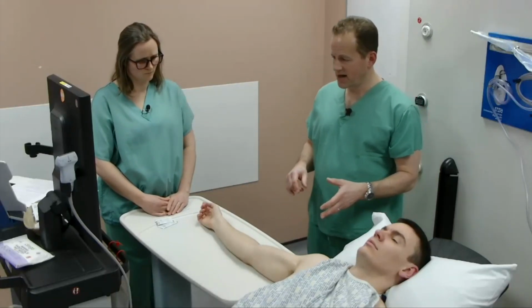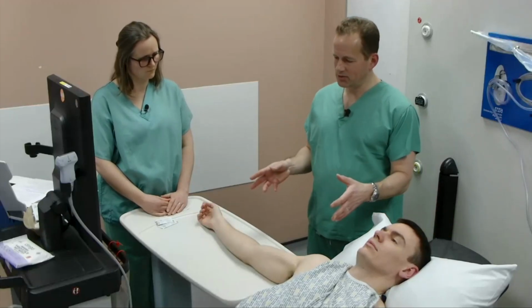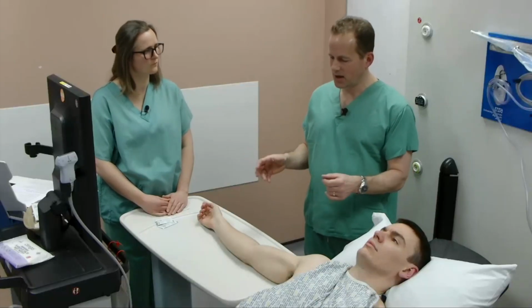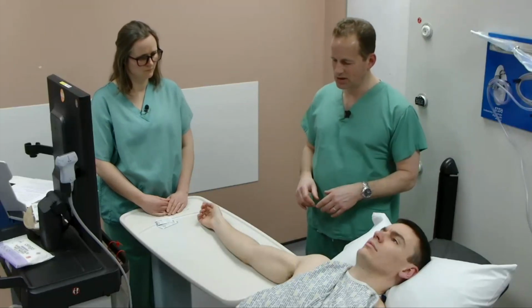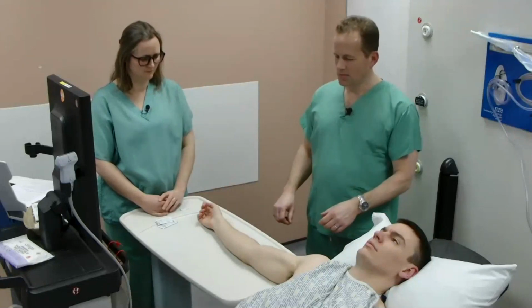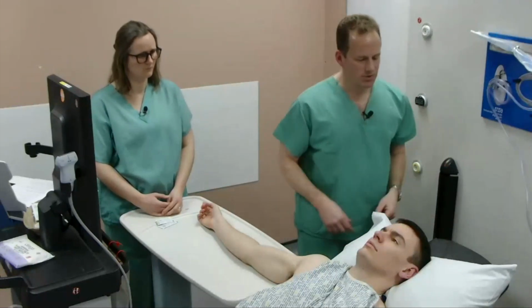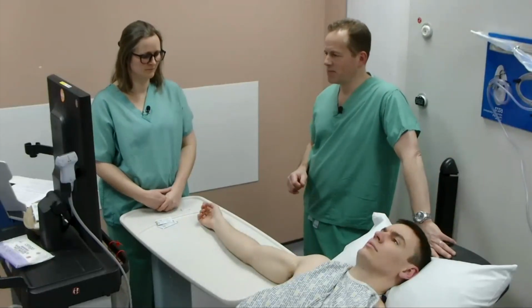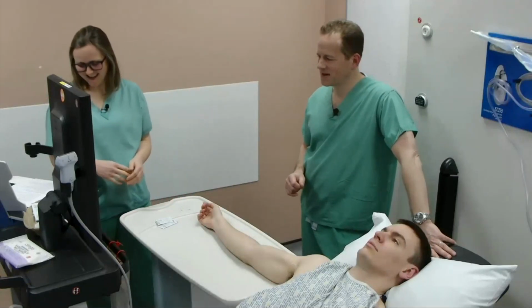The other practical tip I have is, most anaesthetic rooms, if you're going to do it in an anaesthetic room, there's normally one side which has less clutter. And normally in our rooms, it's the side with the cupboards, and the clutter is all on the side of the anaesthetic machines and TIVA pumps and things. So I just spin the trolley, so the arm is always out this way. It might mean that I end up having to face that way to do the block, still at the head end, but just spinning the patient. That just helps make things a bit less cumbersome when you're doing the technique. I've certainly found I have less spaghetti having done that as well.